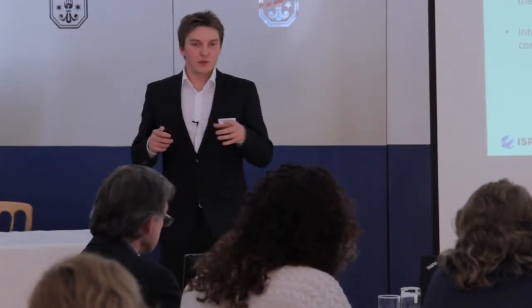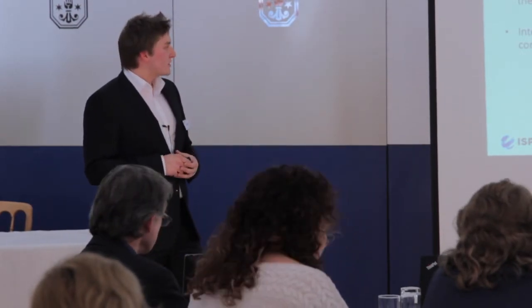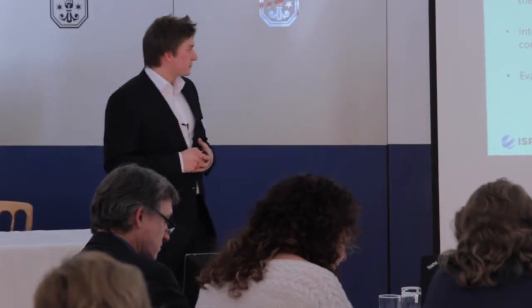But at the same time, we should not look at them as a target of the process. We should use them as a tool. So having one positive BI is not a problem. That's actually a good thing. We have to show where the boundaries of the system are. For this, there is a good trend. Some of our customers are publishing internal white papers, or even scientific community white papers, on how to handle those positive BIs, because they will always happen. There can be cases where a positive BI will appear, and it's good to have some sort of standards for how to handle this.